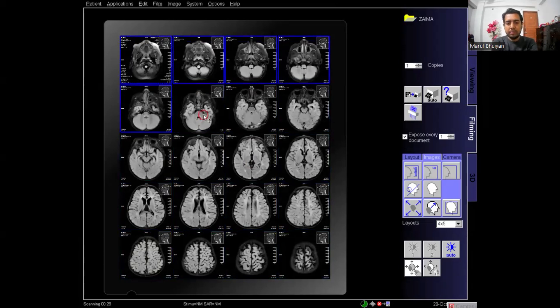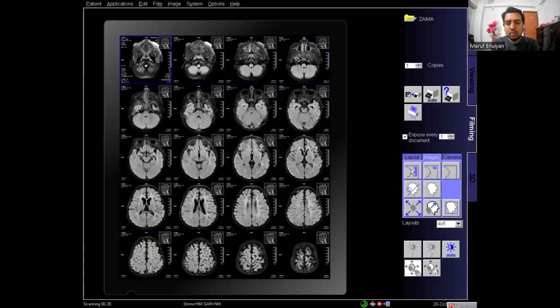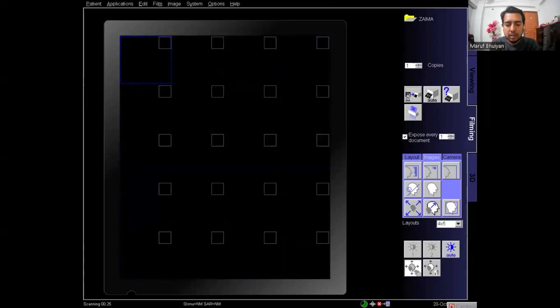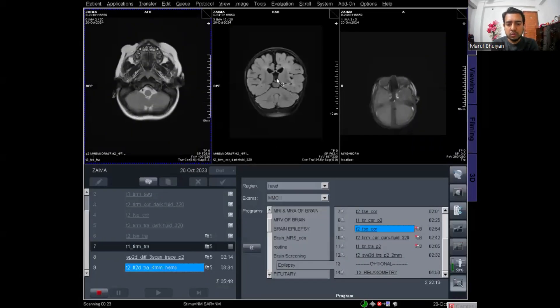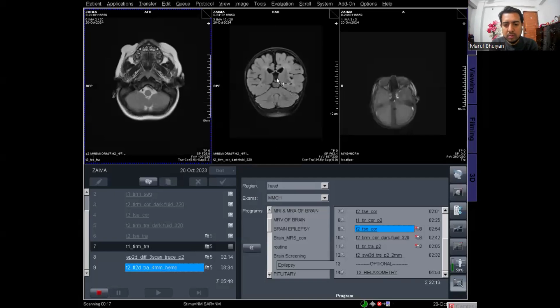For epilepsy brain MRI, you need to take the routine brain protocols plus two or three epilepsy-specific protocols — that is all there is to the epilepsy protocol.